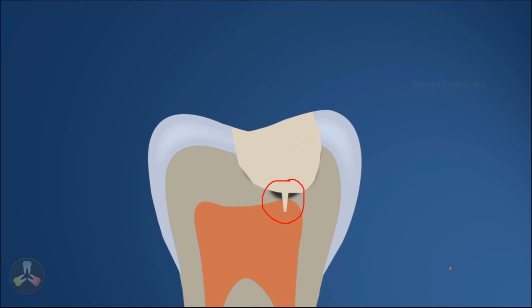It might be painful, but after giving an inferior alveolar nerve block, the chances for pain to be felt with a needle burr will be quite less. So before making this, take a little local anesthetic solution in a small cotton pellet, and place it close to the preparation area, in the deepest area of your preparation. You can give little pressure, and it may not anesthetize, but for just making a small entry inside the pulp chamber, it will be sufficient. You can make a small opening inside the pulp chamber without much pain.